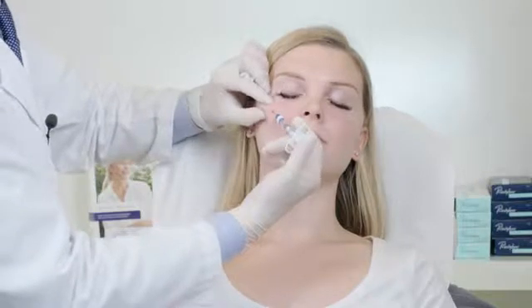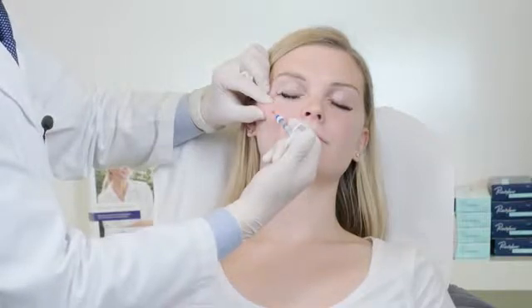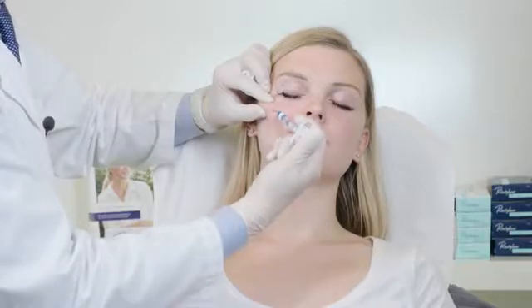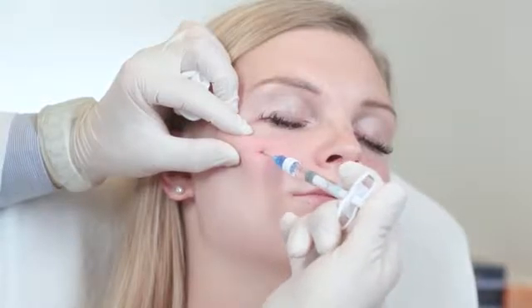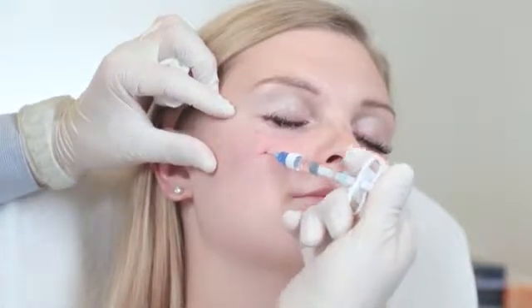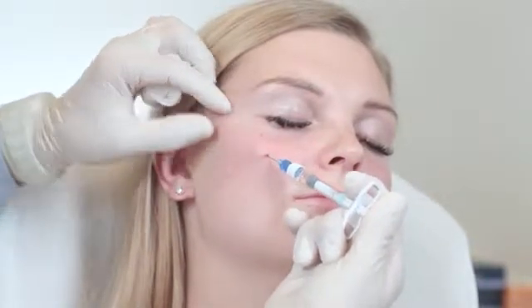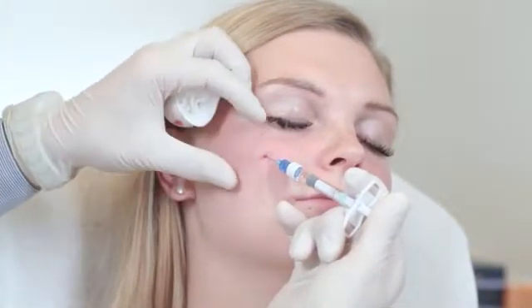Keep in mind that for women the apex of the cheek should be a bit more lateral and a bit higher than in male patients. Now the last step in this injection is the augmentation of the malar fat pad by injecting supraperiosteal into the prezygomatic space. You know you're there when you no longer feel resistance. And again I inject small quantities with low pressure as I watch the tissue augment. It's important not to place too much product close to the zygomatic ligament to avoid any bulging when the patient smiles and talks.